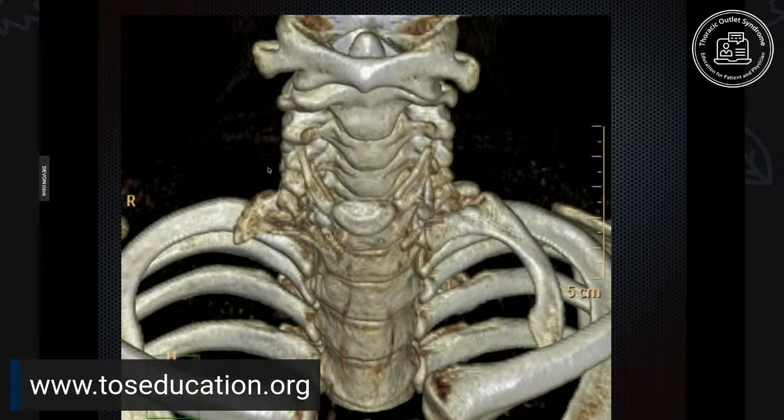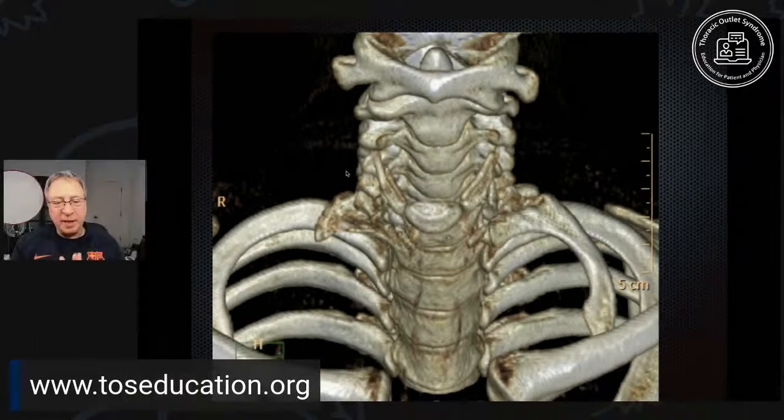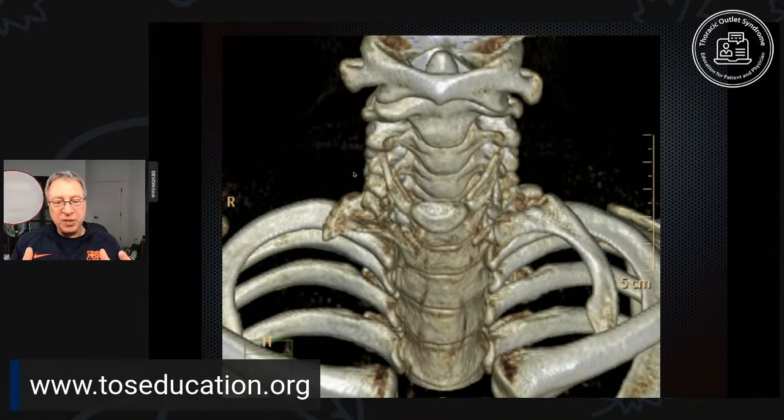You can also turn it into a 3-dimensional picture like this, where the surfaces are well seen. So this is part of the cervical spine. If you look to the right of the picture, you'll see a fairly large cervical rib. And you can take this model you've created and rotate it in all kinds of different planes. So for surgeons or docs who aren't used to looking at images all day like a radiologist, this can be quite helpful to demonstrate complex anatomy.